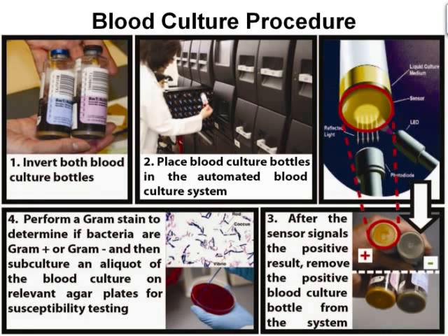Incubation is for 5 to 7 days, although most pathogens will grow within 1 to 2 days, and often extended for 14 to 21 days for suspected bacterial endocarditis, brucella, or yeast. However, some controversy exists on the extended incubation time. Bottles are continuously monitored for microbial growth.